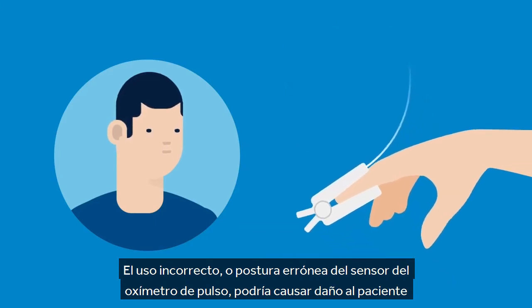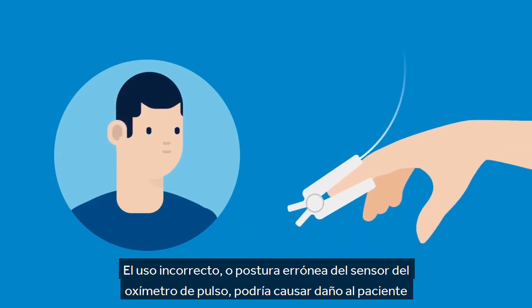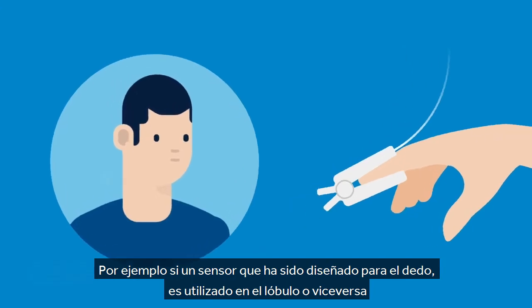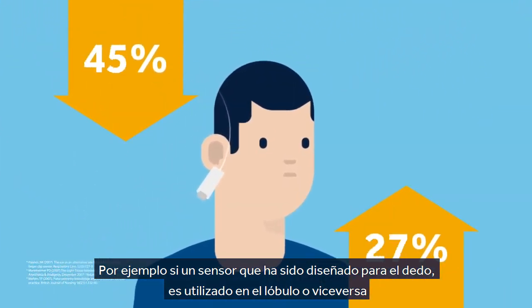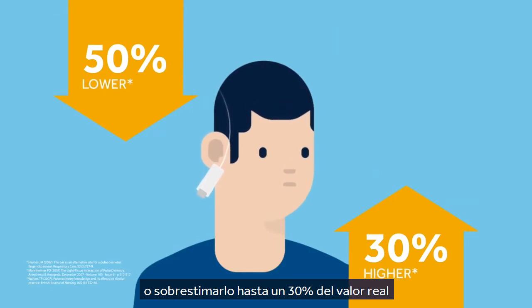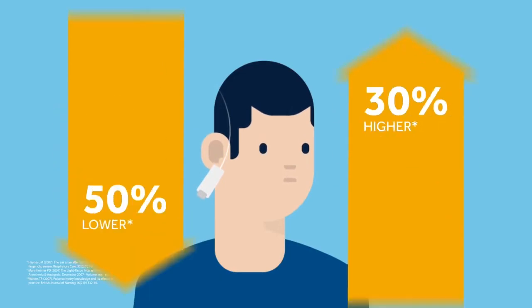Incorrect use or placement of pulse oximeter probes can cause harm to patients. For example, if a probe is intended for a finger but is attached to an ear or vice versa, it can produce a reading of up to 50% lower or 30% higher than the real value.